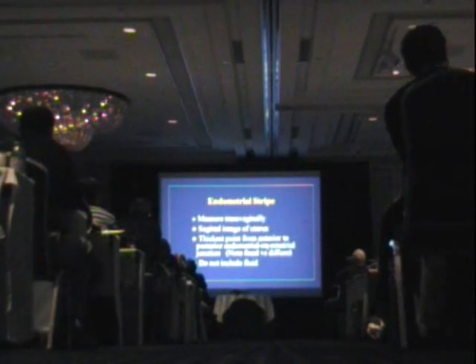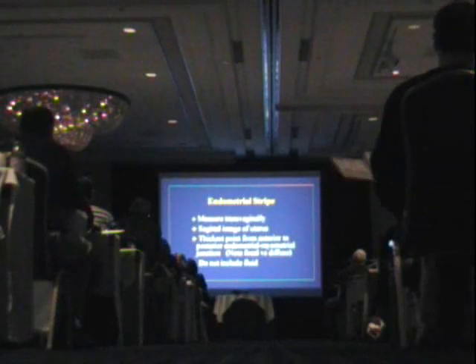When you measure the endometrial stripe, and a lot of what we talk about with the uterus has to do with what the stripe measurement is, for postmenopausal bleeding patients, for any patients who are bleeding, for IVF patients, infertility patients. The endometrial stripe must be measured transvaginally, and it must be measured on a true sagittal image of the endometrium. It cannot be off-center. The measure reported is the thickest point from the anterior to posterior endometrial junction.